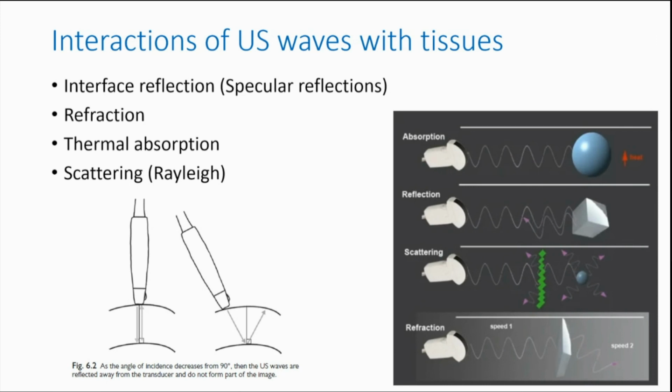So for deep blocks where the needle is not necessarily perpendicular to the beam, you have no choice but to depend on tissue movement to decide where the needle is. Because you can have the most expensive needle in the world, but it's not going to reflect enough of the ultrasound beam towards the ultrasound probe. But if you are doing a procedure with a linear probe on a superficial structure, then you can ideally see the needle.